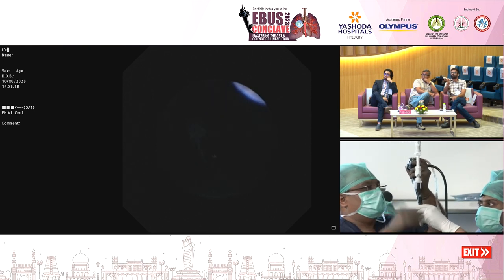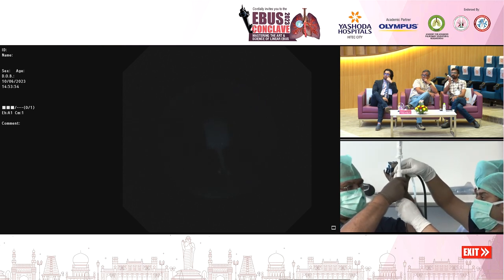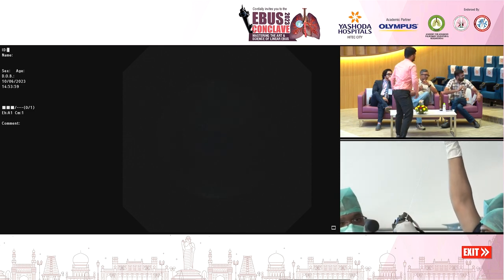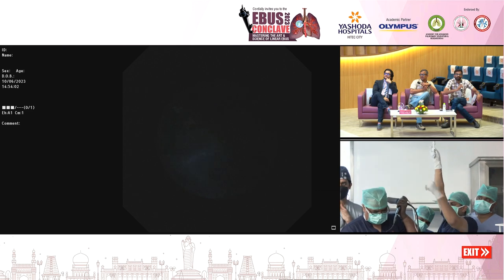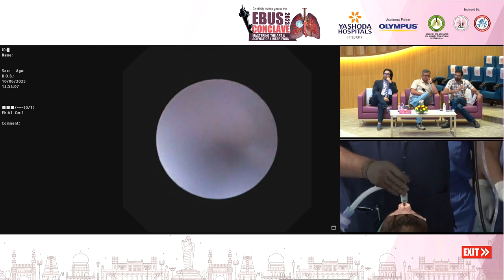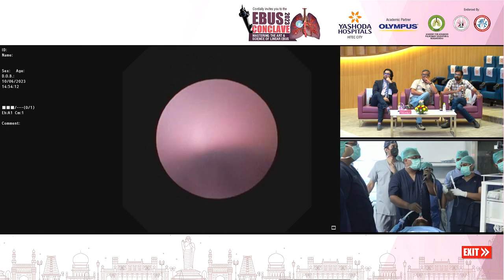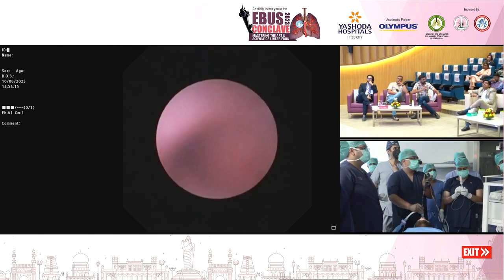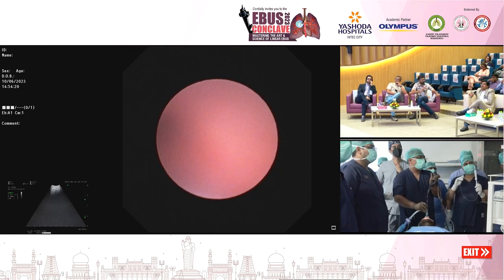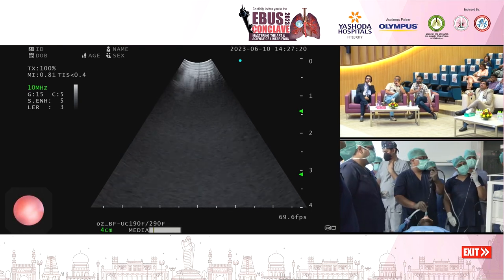This is how we fix the needle, and now we'll go inside and do a pass with the 19G needle. So this fixing of the sheath can be done inside also. Yes. Here it was demonstrated outside, but for those who are seeing, most of the times it is done while the scope is in the trachea, in the neutral position. So that is where the sheath is usually fixed inside. As they were measuring the lymph nodes previously, they could come back to the trachea and then see the sheath and then continue the passes. So here for the purpose of demonstration, they had removed it out and demonstrated it.